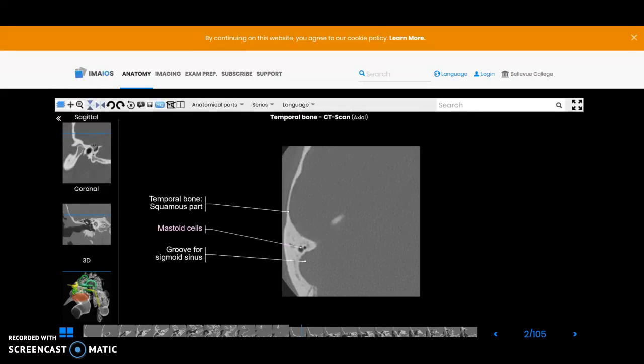Now we'll take a look at the slices axially of the internal auditory canal, or internal acoustic canal as it's sometimes called.